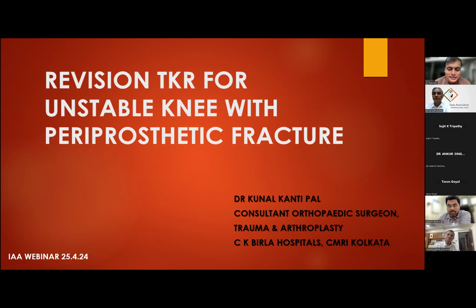There are 2 points. One is that not all systems have this deep dish insert, so you have to be careful. But if you're in doubt, it's better to do a PS knee straight away rather than thinking about all these dishes. Okay, thank you, sir.